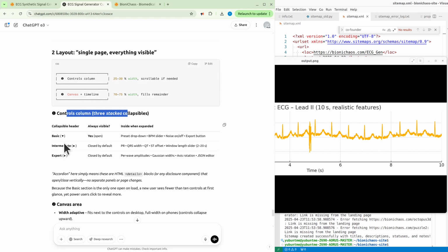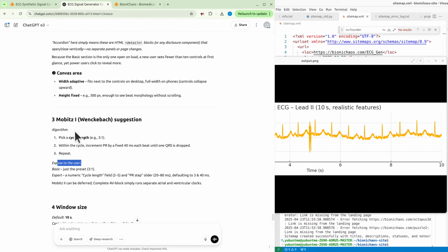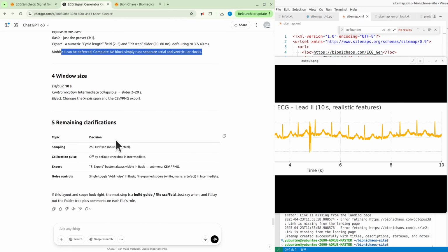Okay, I need to see it to believe it. Okay, and we have controls, basic, intermediate, expert, closed by default, so only basic is visible. That sounds legit. I'm not sure about this bit. Yeah, we're changing window size. Yeah, it's actually making some decisions as well, which would be better than my own, considering I don't know much about it. More than happy to get any expert input on this. And we have some remaining clarification. Yeah, so sampling is 250 Hz. That should be fine. No user control.